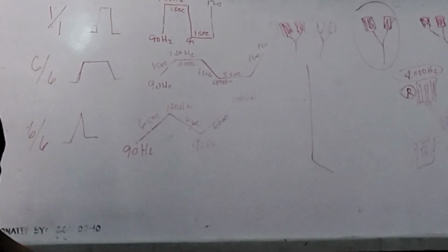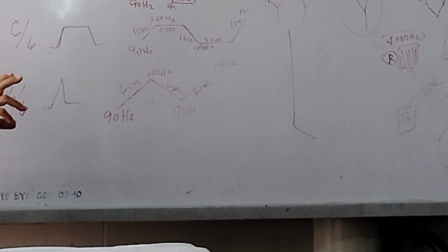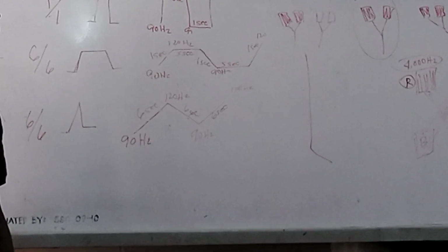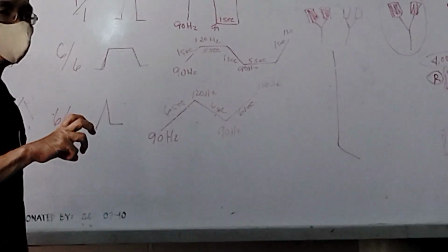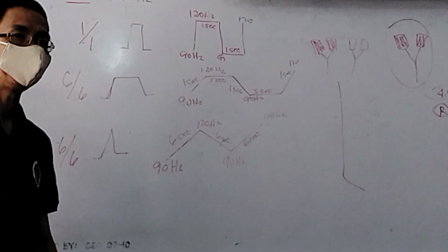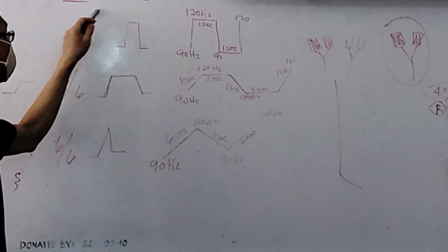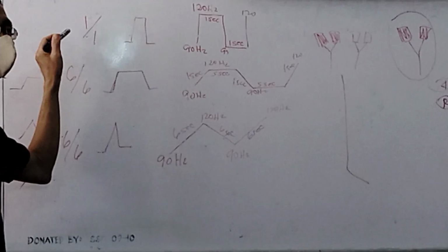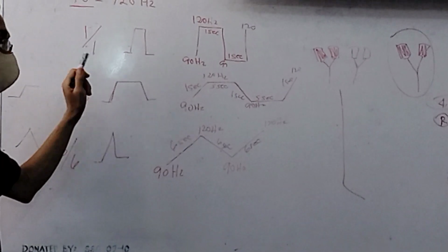If ever your spectrum program has abrupt variation or sudden changes, we usually expect that the stimulus is more aggressive. Because the changes are quick, it is aggressive. Therefore, we would expect this is really aggressive. So, we prescribe this during chronic condition. Okay.